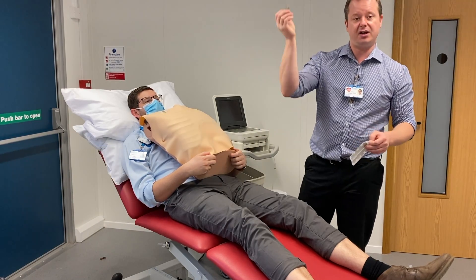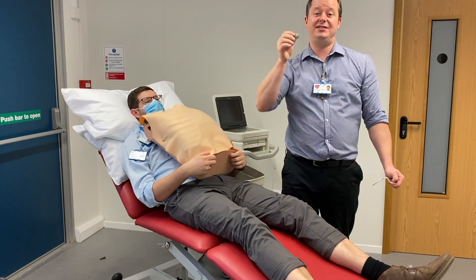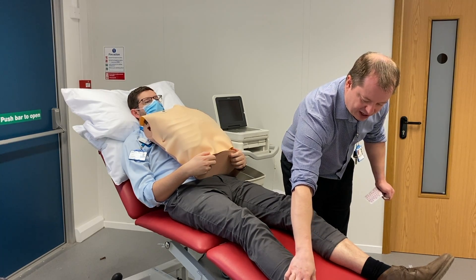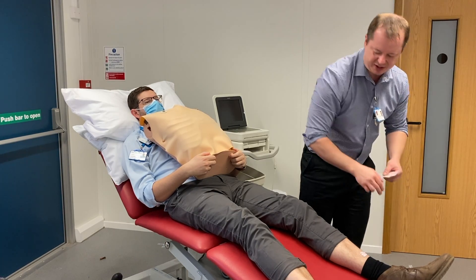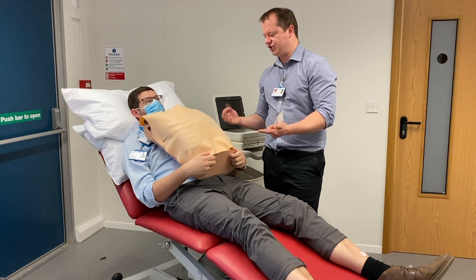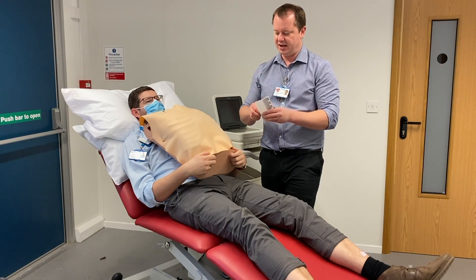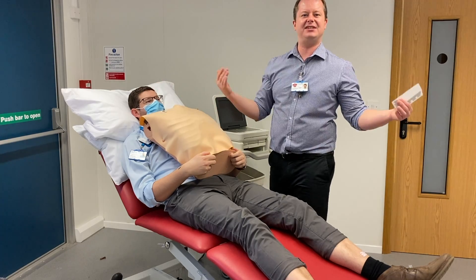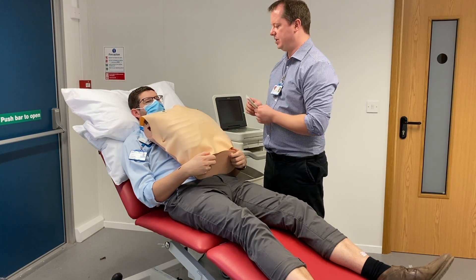We tend to put the stickers on a bony prominence, which actually reduces the interference that you might get with ECG. When you put the limb leads on, you want to put them at the end of the limb and on a nice bony surface - so on James's shin bone and on his wrists. We're going to stick the stickers on a bony part of his wrist with the tab pointing outwards on both limbs, which makes it easier for the wires to come in and they don't tend to peel off.